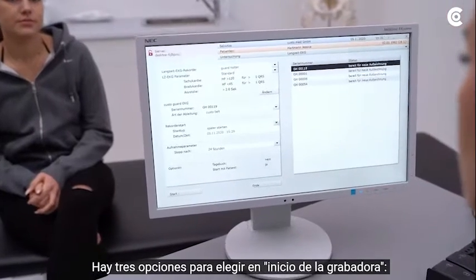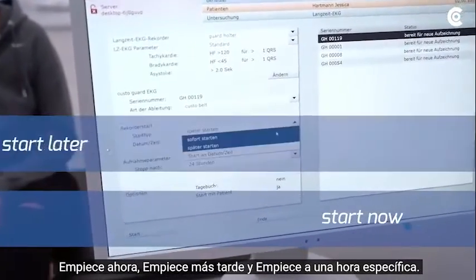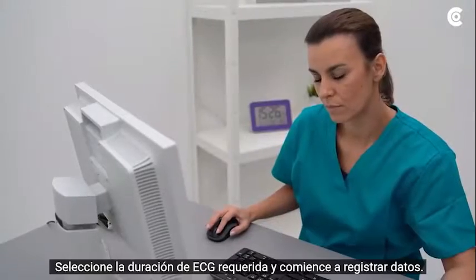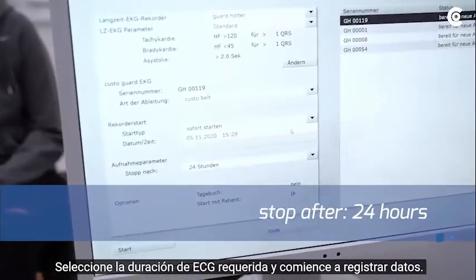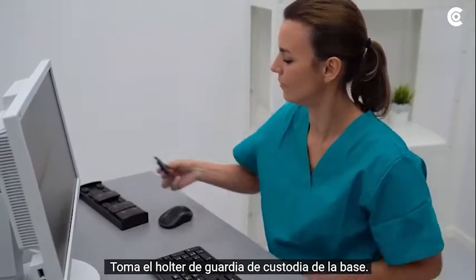There are three options to choose from under Recorder Start. Start now, start later, and start at a specific time. Select the required ECG duration and start logging data. Take the CustoGuard Holter from the base.